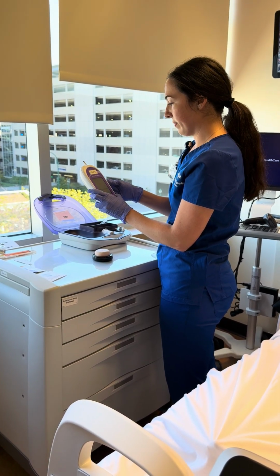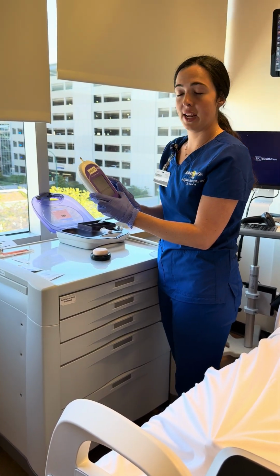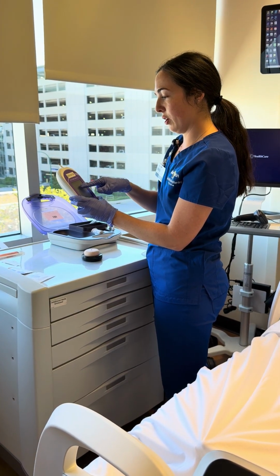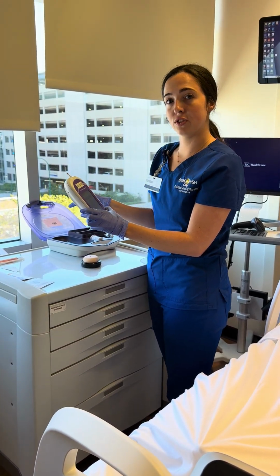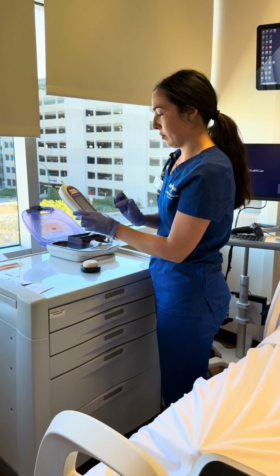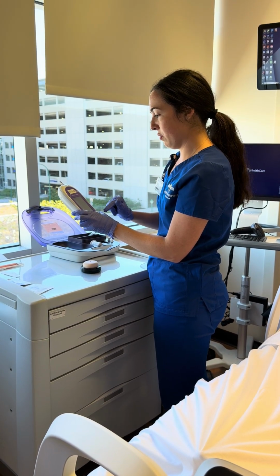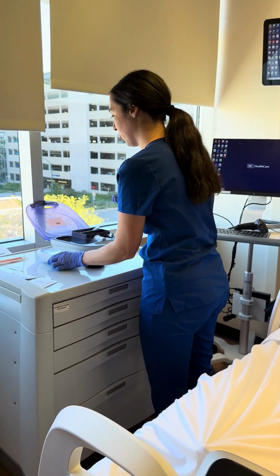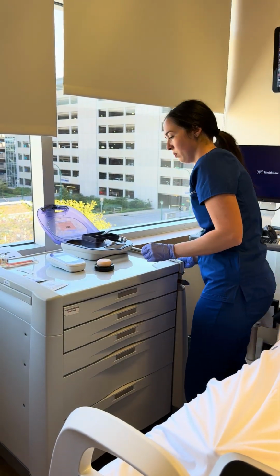So it looks like we have an out of report range, so it is high. So we're going to go ahead and notify our house supervisor for today. Go ahead and send that through, so they've been notified. Press OK, and we're done here. So I'm going to go ahead and throw this away.